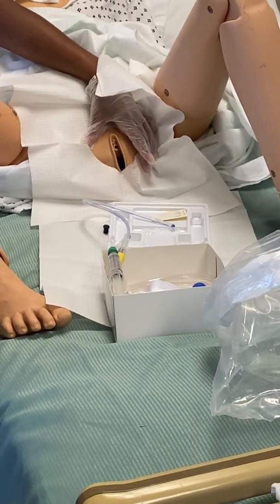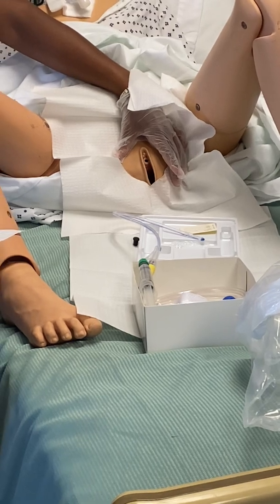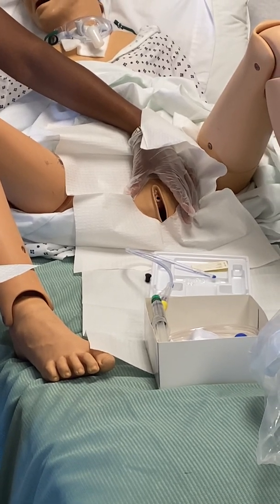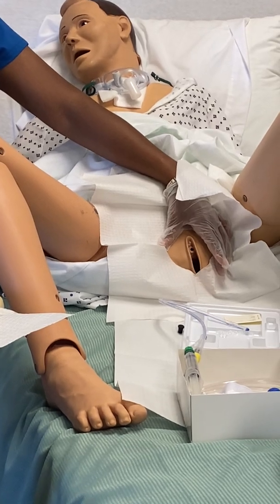Now, you may want to get to a point where you do farthest to closest. So if you want to do that far side first, the middle, and that closest side, that's fine. You should still pass your competency. Okay? But do not do closest to you and work farthest away from you.